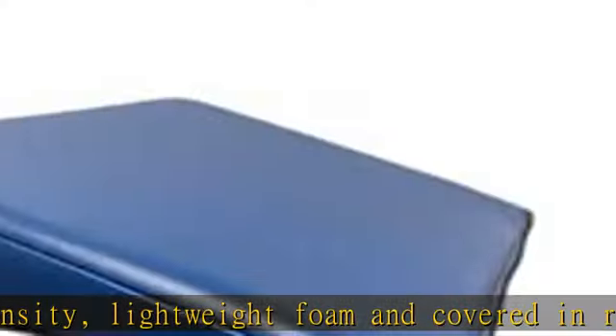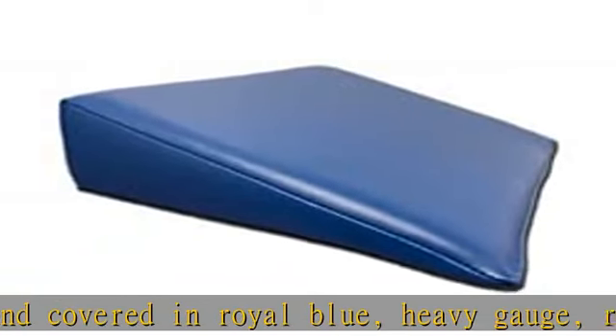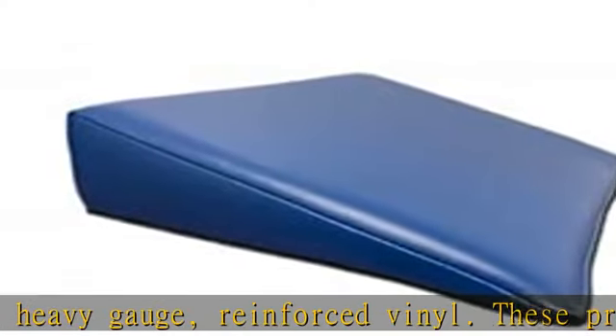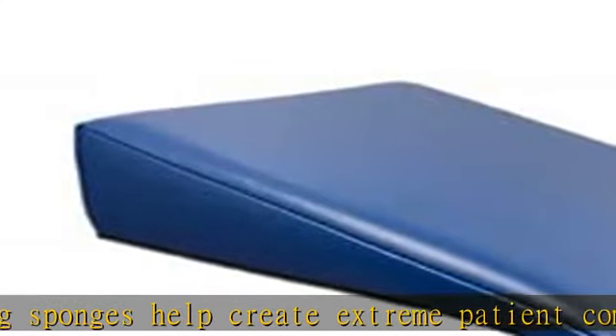Featuring a non-porous, cleanable surface, these durable vinyl sponges also include completely sewn seams to ensure complete protection and sanitation. Vinyl covered sponges are radiolucent, but seams will show under x-ray.